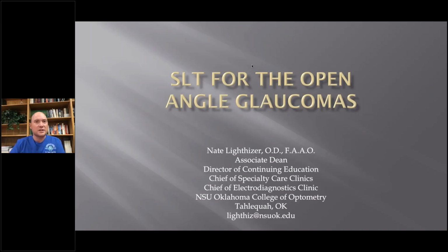We know traditionally it's been that you considered laser trabeculoplasty, specifically ALT, when it came about in the late 80s and in the 90s and early 2000s. ALT was after maximum medical therapy, whatever that was for that patient. Where do you consider that for SLT? We'll cover that along with many other topics as well.